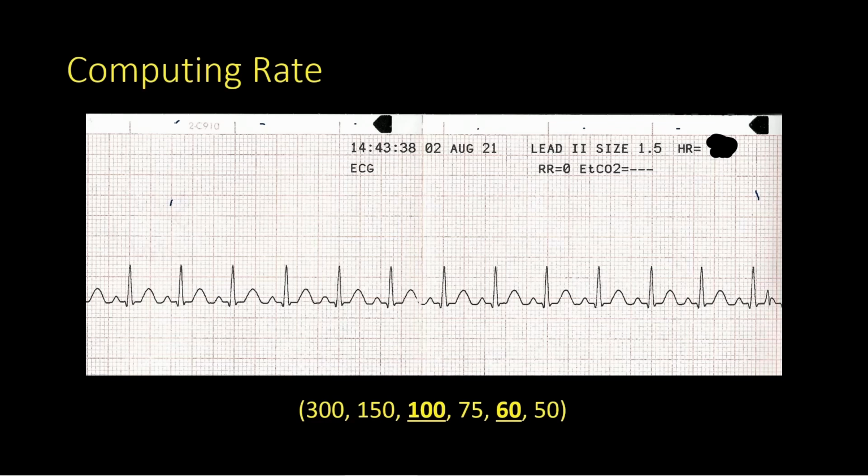Now let's look at it doing the countdown method. We start right on here. This is pretty close to the solid line. So we say this is where the starting point will be right here. And we have 300, 150, 100. So we know that somewhere between 100 and 150 is the rhythm. So I'd say again about 120 would be correct.